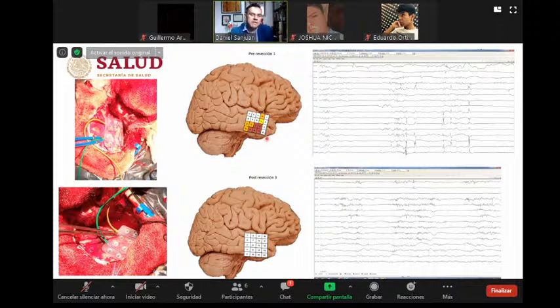We can detect and map in this grid the areas that are more irritable, and then the area around that spreads these epileptiform abnormalities, and how it is possible to see, after the resection of the pole, that the huge abnormality is located not in all of the pole of the temporal lobe, just in the inferior temporal gyrus.